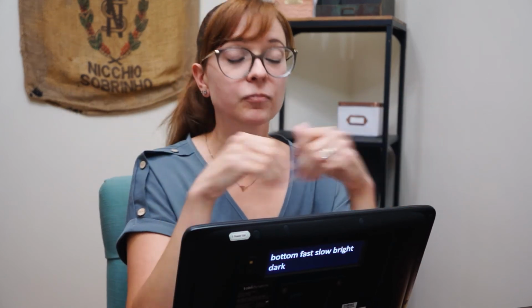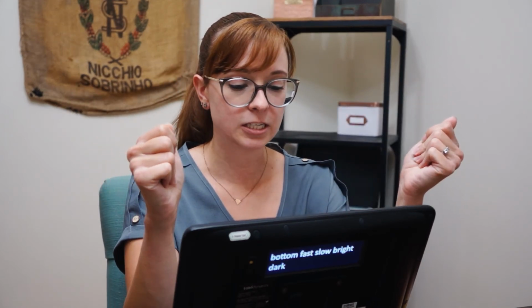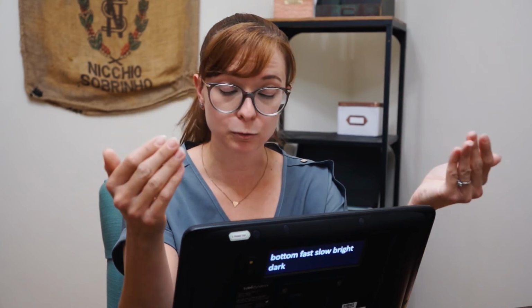So to reiterate, when starting with teaching through modeling, you want to start small and simple. Sit down with a planned activity and just sit on a single page and use that language and model that language. And this will just help teach intention, purpose, and help your individual learn these words.